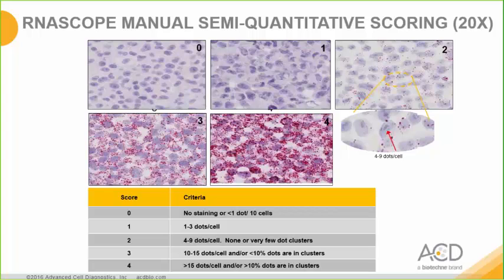4 to 9 dots per cell with no or very few dot clusters is a score of 2. 10 to 15 dots per cell and or less than 10% dots in clusters is a score of 3. Greater than 15 dots per cell and or greater than 10% dots in clusters is a score of 4. The images here give you an idea of what each score may look like.